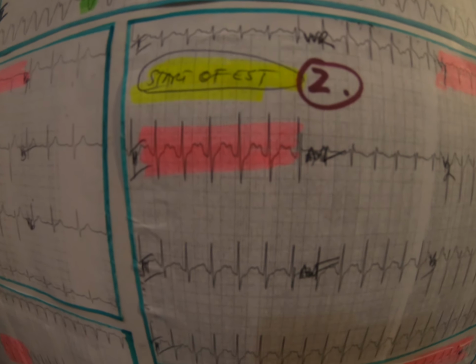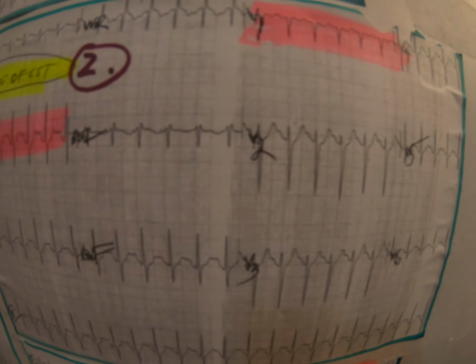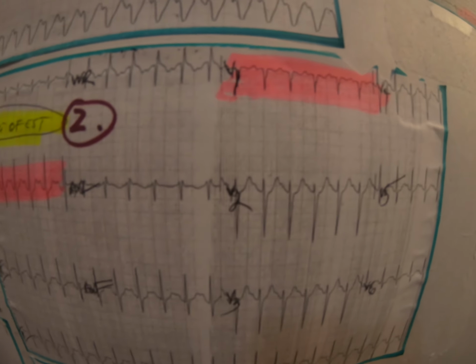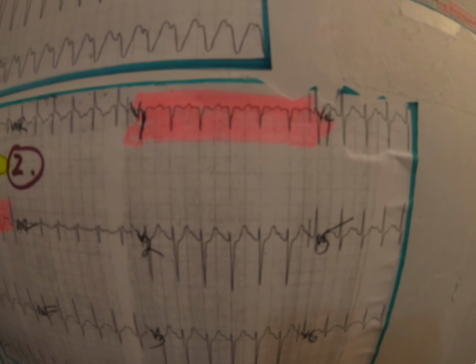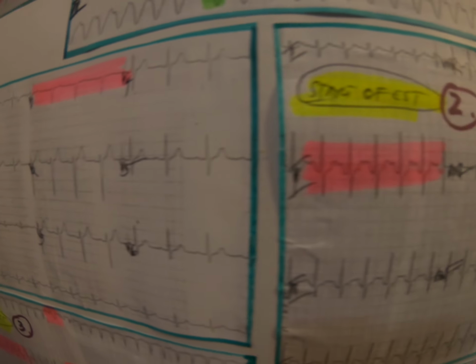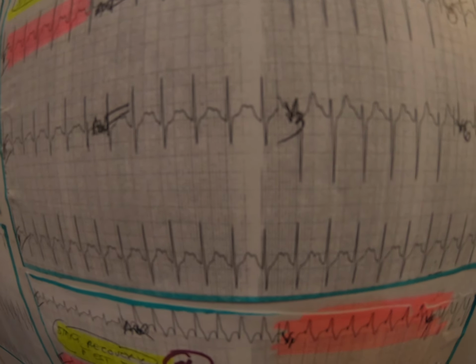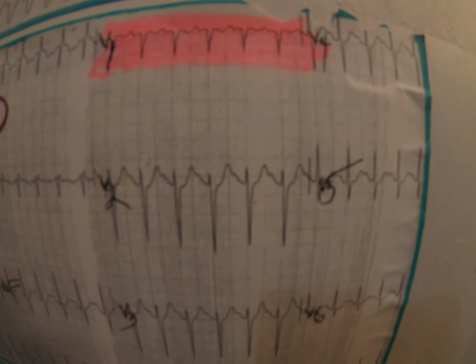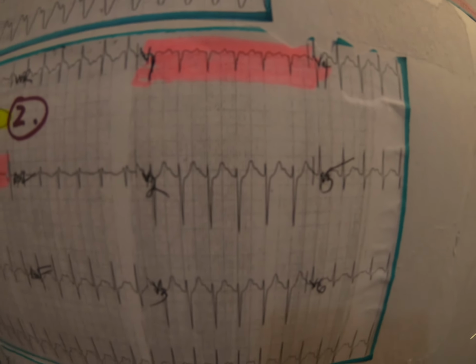So at the start of the test, the patient tachys, so the patient's rate went fast. As I said for the VTAC, don't look at the limb leads. You go to the chest or precordial leads, V1 to V6. So now you see that it became faster. So earlier it was slower, sinus. Now the patient is probably at 150. This is probably maybe about 140. So tachys. So the rate went up. Okay, start of the exercise.